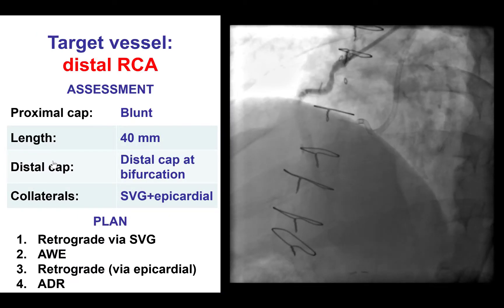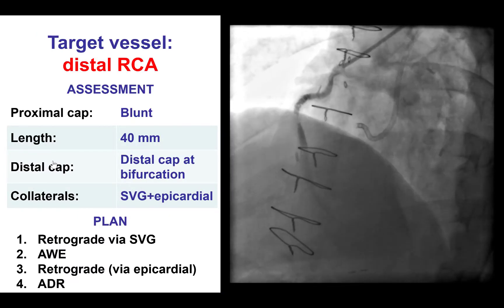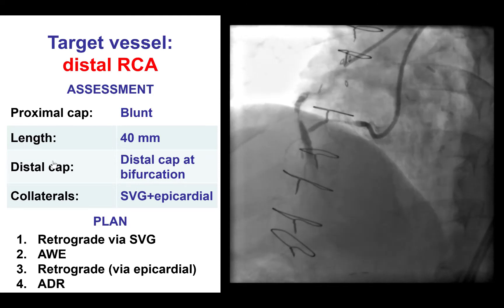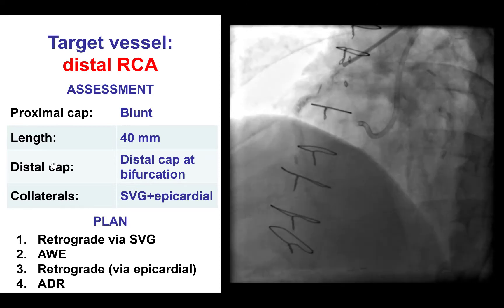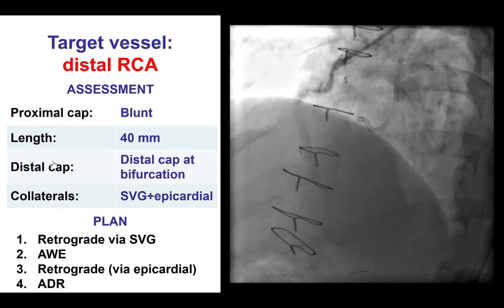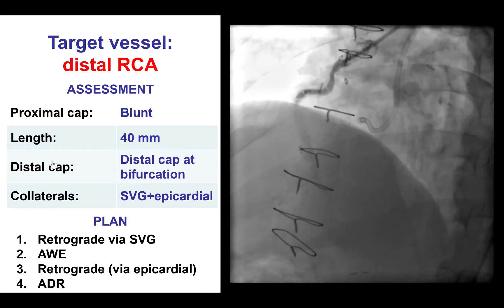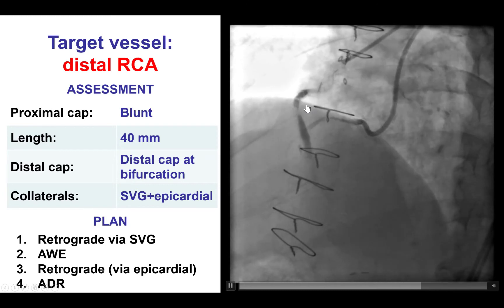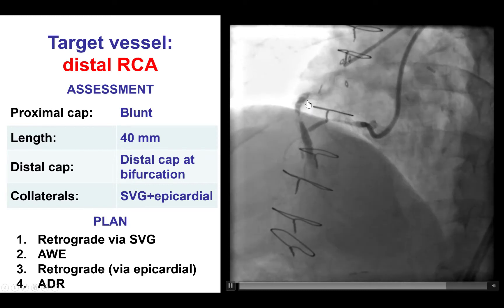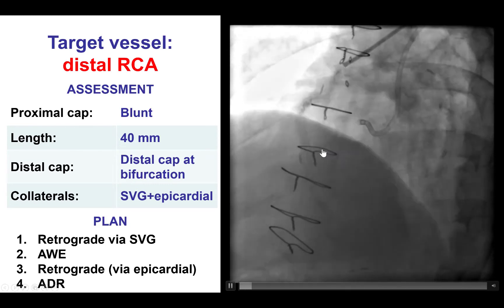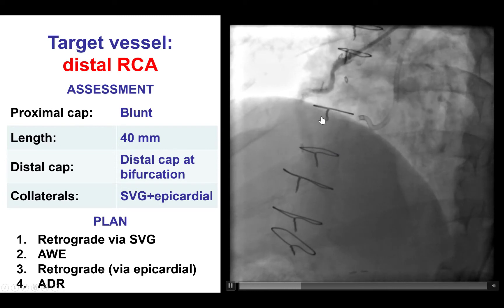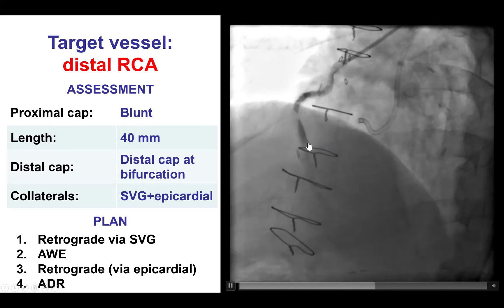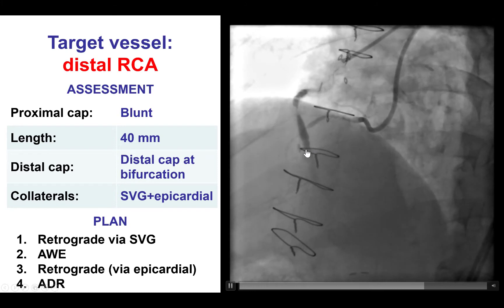After discussion with the patient as well as the referring providers, a decision was made to attempt re-canalization of the native right coronary artery. Because we know that in heavily degenerated saphenous vein grafts, as was this one, the long-term patency can be fairly low even if acute success is achieved. Moreover, the risk of intervention on this graft is not insignificant given the high-grade appearance.